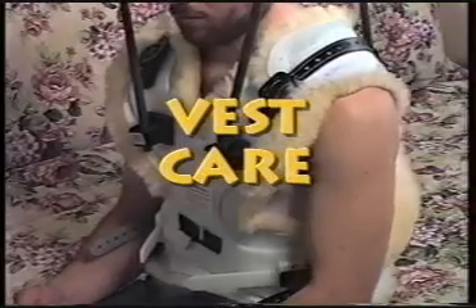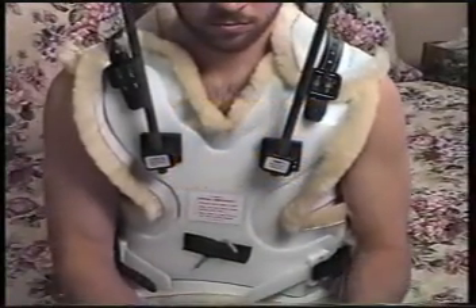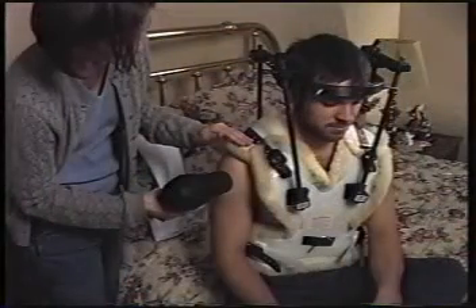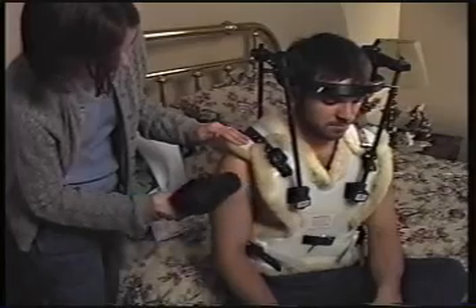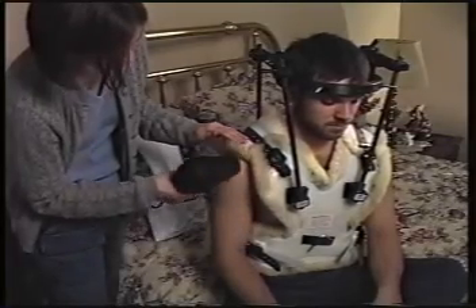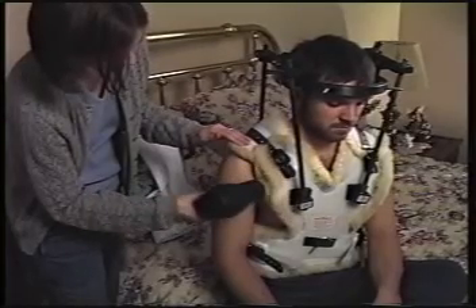It is extremely important that the vest fits snugly but allows you to breathe and move normally. Keep the vest liner dry at all times and do not remove it. If it gets wet, dry it with a hair dryer on a cool setting. If it gets dirty or develops an odor, call your doctor or nurse to ask about cleaning it or having a new liner put in. If you develop skin irritation under or around the vest, ask your doctor or nurse to trim it or put in extra padding.